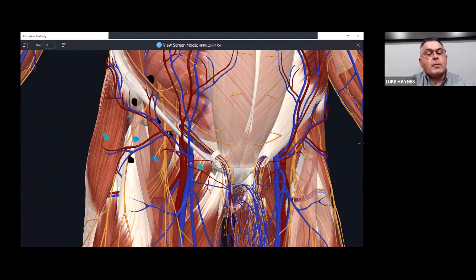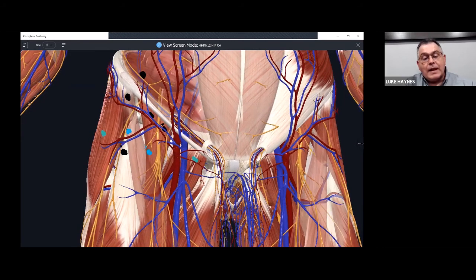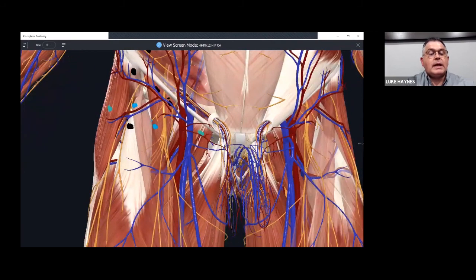Iliofemoral, or sorry, pubofemoral is through sartorius deep. And then lastly, we want to needle into pectineus and then the iliotibial or tensor fascia lata here. So again, the biggest issue is being cognizant of femoral nerve, artery, and vein, and using appropriate finger breadths to stay away from those areas, as well as the contents of the digestive tract on iliacus. But needling into this, again, we get very good response results from hip OA and impingement.